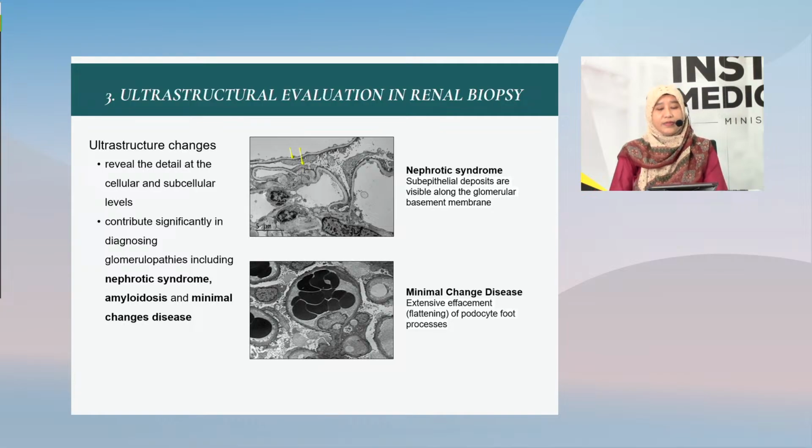Okay, EM techniques are also crucial in renal biopsy, where renal biopsy is the gold standard for diagnosing renal disease. In recent years, EM has been widely used as a supplement to other existing methods, such as immunofluorescence and light microscope techniques.